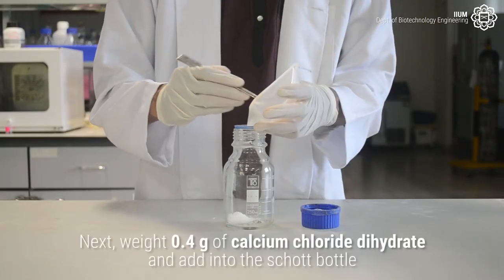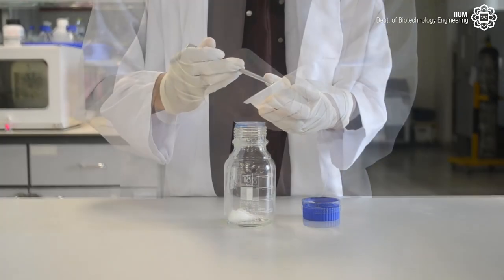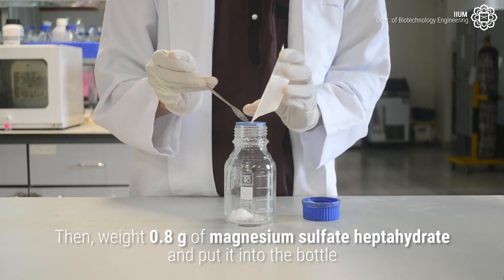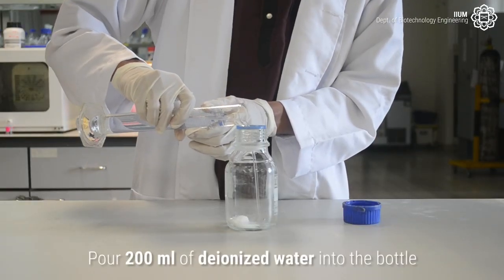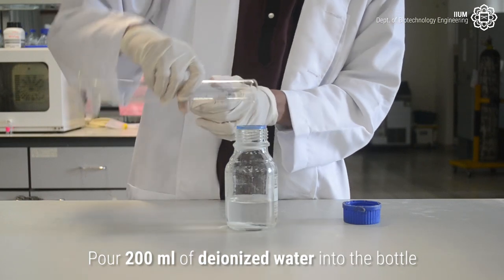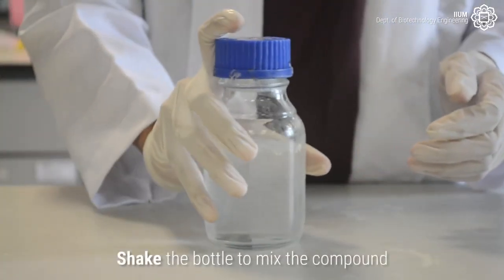Next, weigh 0.4 grams of calcium chloride dihydrate and add it into the bottle. Then, weigh 0.8 grams of magnesium sulfate heptahydrate and put it into the bottle. Pour 200ml of deionized water into the bottle. Shake the bottle to mix the compounds.